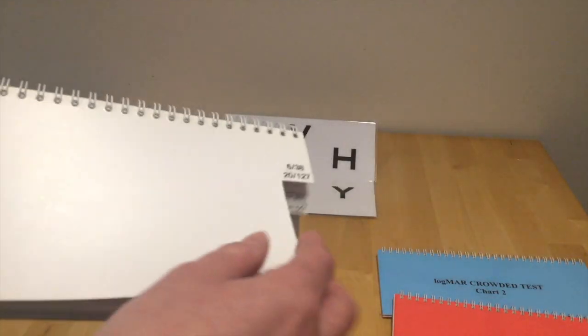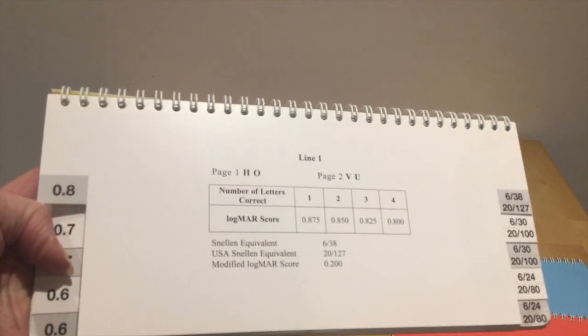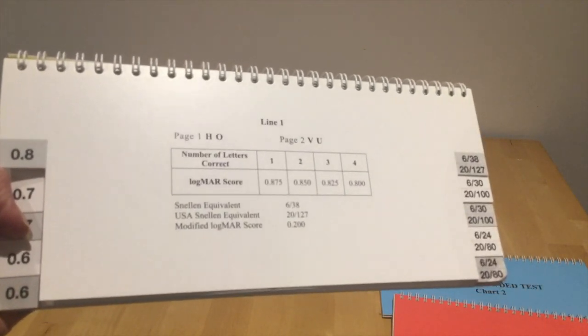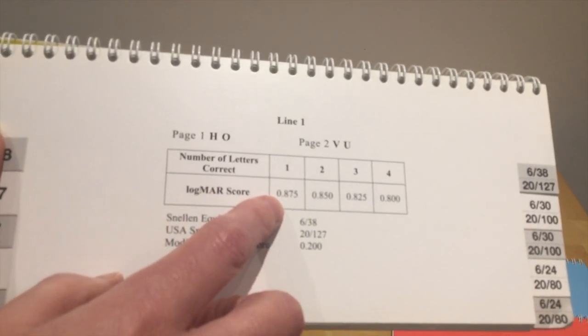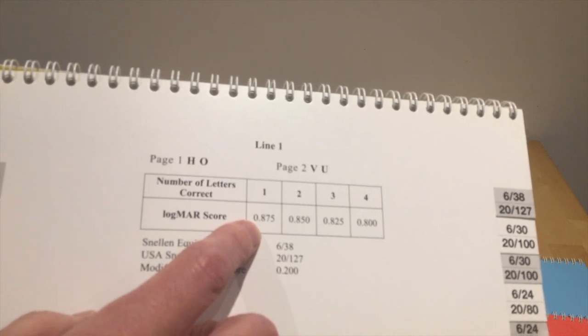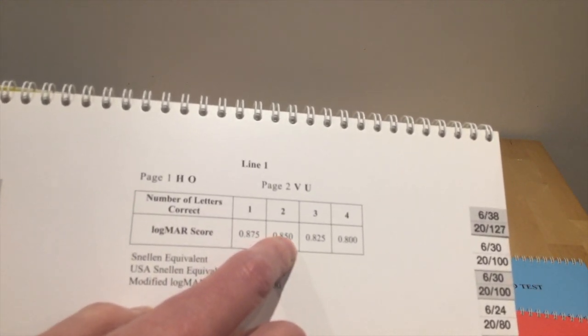When we flip it over, it's telling us the answers already. So page 1, it's going to be the letters H and O. Let's just turn it round and double check. Yes, we're correct. So again, if the child or young person gets 1 correct, then their logMAR score is 0.875. If they get 2 correct, it's 0.85.